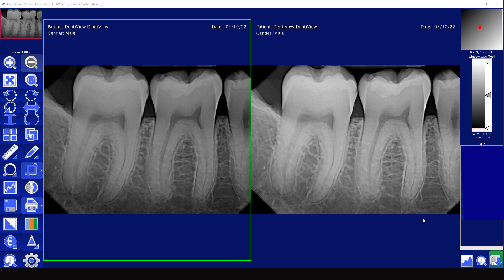Hello, today we are going to be going over all of the different tools you have inside of the viewing portion of Dentiview imaging software.